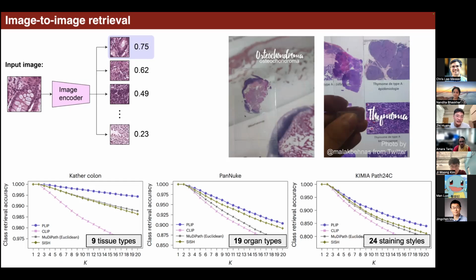But on the clinical side, tissue type diagnosis is even more important for a lot of clinicians, because one of the most painful clinical diagnoses is differential diagnosis, meaning, okay, we know this is a breast adenocarcinoma, but can we further make an additional differential diagnosis upon the fact that it is already a tumorous tissue? And that is really painful.